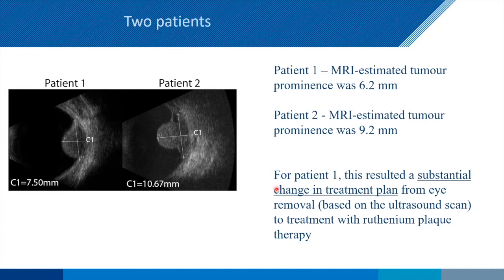And also, if you're young, which tends to be the age group where this is effective, just having your eye physically there, rather than having an eye removed, is an incredible psychological boost. So here's an example where this really high resolution that we always think about in terms of MR actually has practical clinical relevance. And there's lots of other clinical things that I could go through in terms of high field MR.